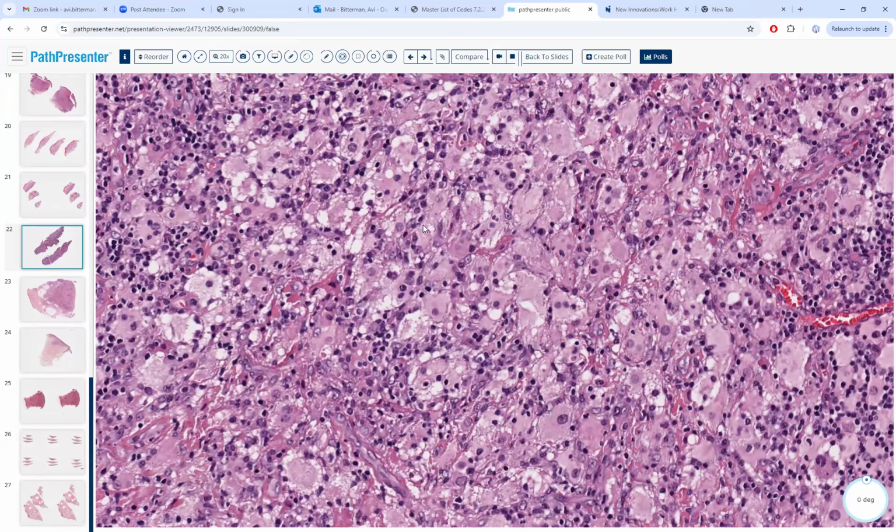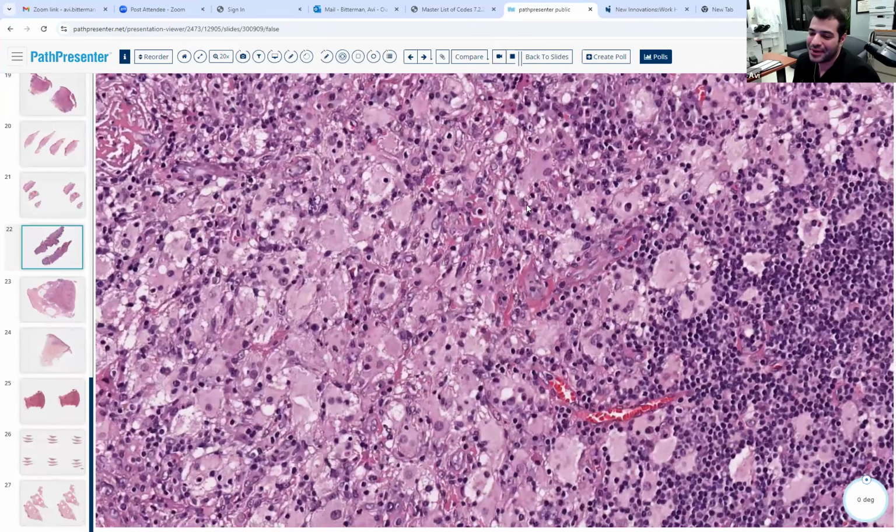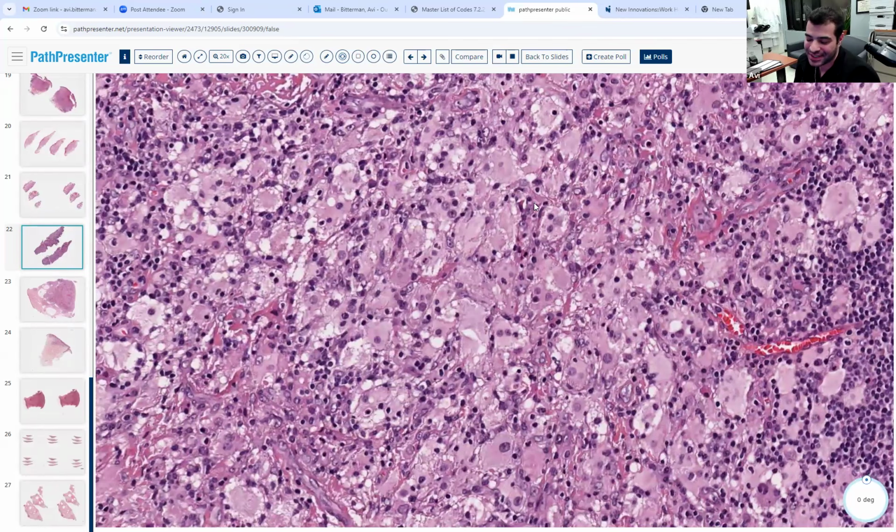This is a non-Langerhans cell histiocytosis. What about S100? How's that going to stain? Negative. Positive. Negative. Oh, negative. It only stains positive for CD68, I think. Hold on, let me see. It stains for S100 too. I'm pretty sure it stains for S100. So my understanding is S100 positive, CD1a negative, Langerin negative. But S100 should be positive.